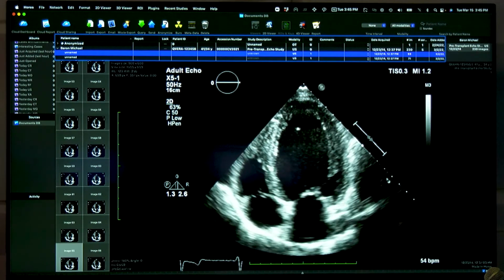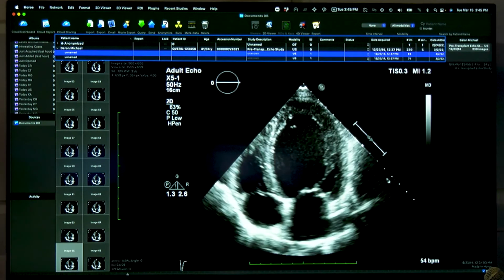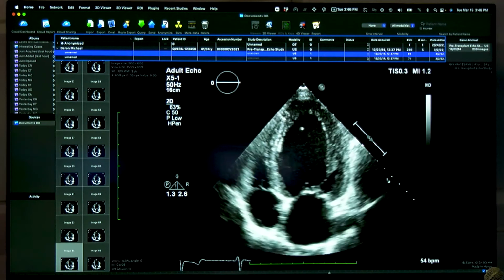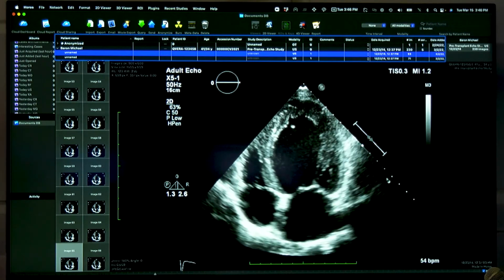Now, the struggle here is that I need to get this data in front of the cardiologist in his EMR. Both the history from Peraton as well as this DICOM, the cardiologist's EMR cannot accept. So what we do is we go ahead and convert the JSON file into HL7 and send it into the EMR. For the DICOM, we open that up and we get the attributes from it as well as some of the images, and we send that into the cardiologist EMR. This now gives the cardiologist all the information he needs to be able to make a diagnosis.